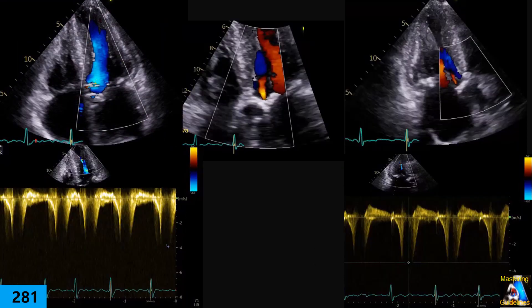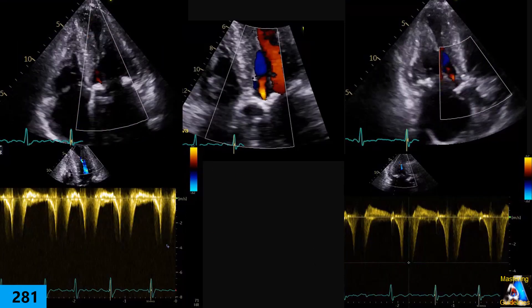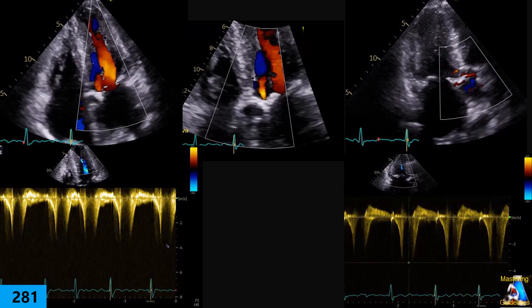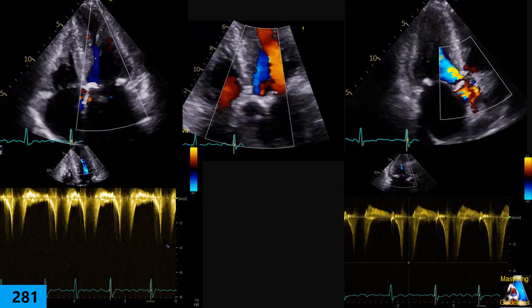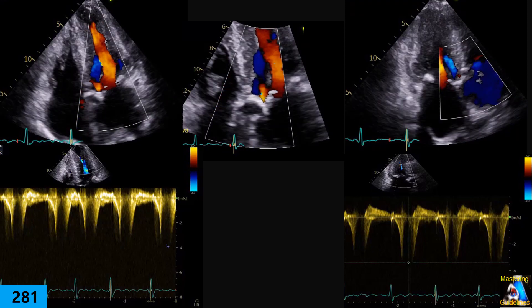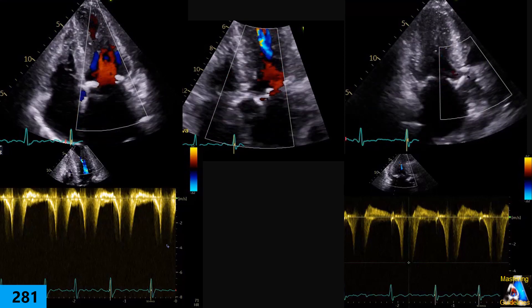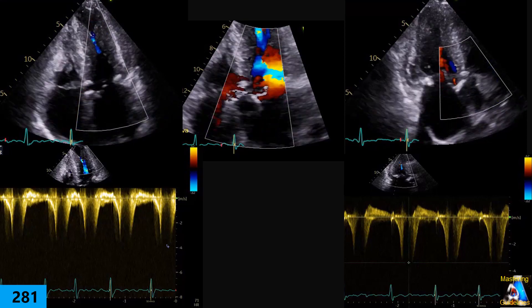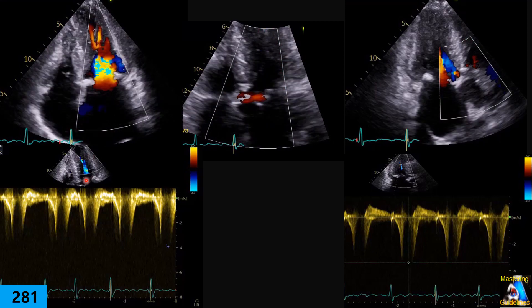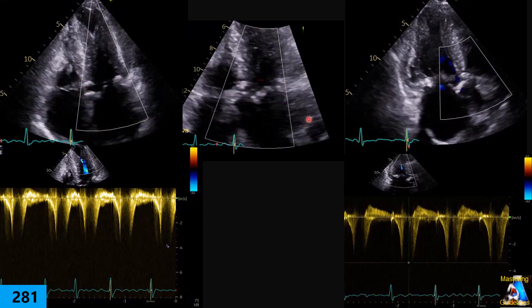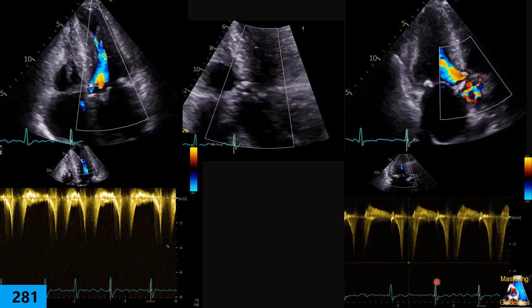This is a very interesting case. We have here, as you can see, apical views between 4 and 5, and 5 and 3. And then we have Doppler on the apical 4 at this level, as you can see, and then on apical 3.